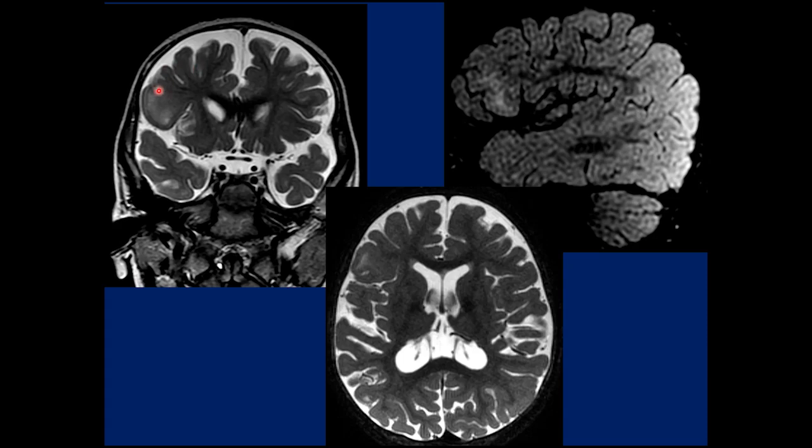And how about the medial limit of my resection? The medial limit is the white matter. So, where to stop? If I go too deep, I can reach and open the ventricle. I don't want to do that. One good landmark could be the end of the upper surface of the insula, that is the superior limiting sulcus of the insula. If you go deep, deep, deep, and then you see that the insula is over, you have to stop. Otherwise, you might enter the frontal horn.